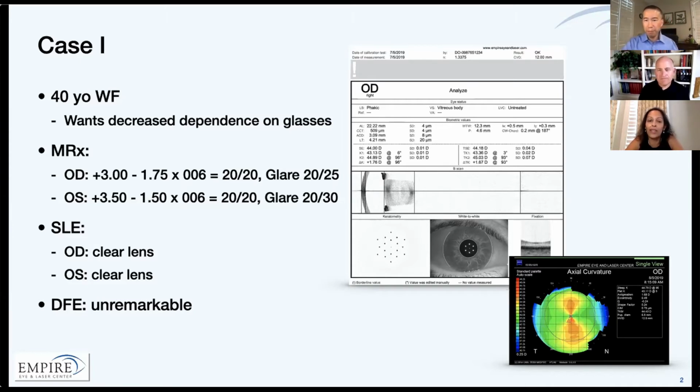And of course, back then we didn't have the 700. And so I wasn't even able to catch these little areas in the foveal centration. So I've really started just doing it all. I find that with the speed of the 700, the fact that the OCT is just down the hall for us, getting all three measurements, the biometry, the topographer, and the OCT macula, before I even step foot in the room is really helpful for my clinic flow. Now I have trained my technicians to look at the topography, and if it looks really strange, to just stop the whole process right there and come and grab me. But that's how I've changed my clinic flow.